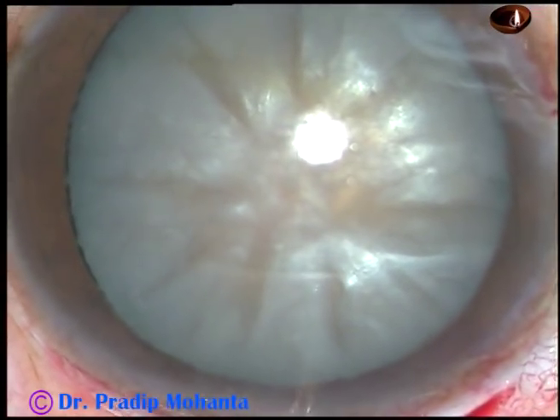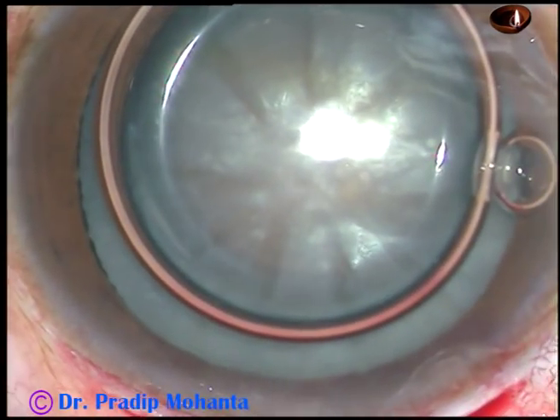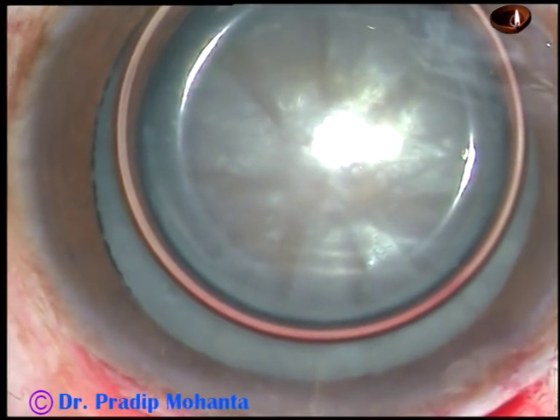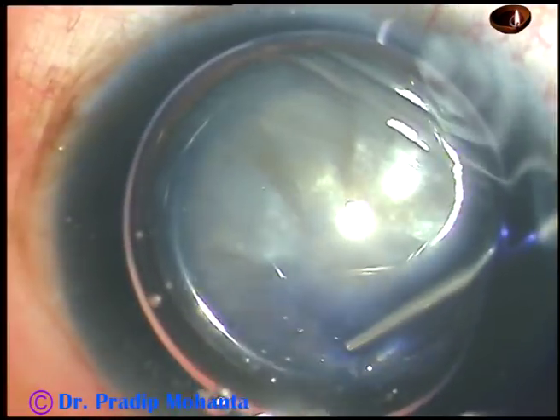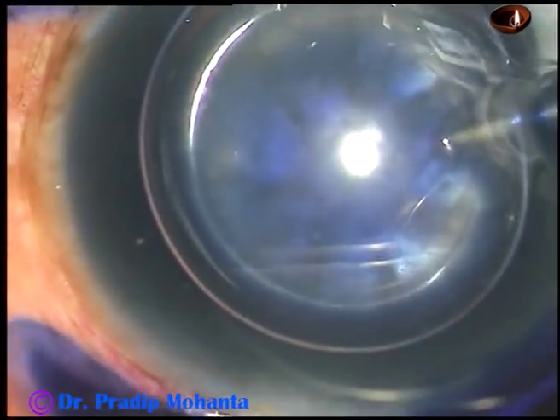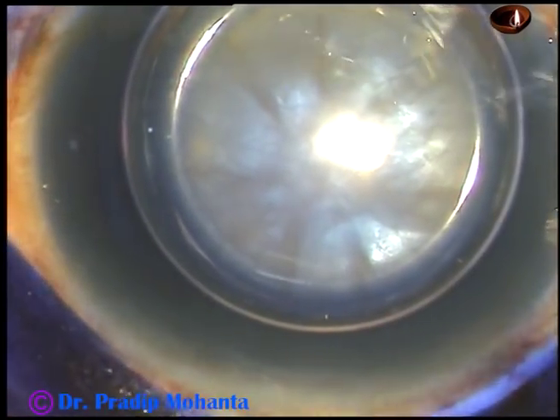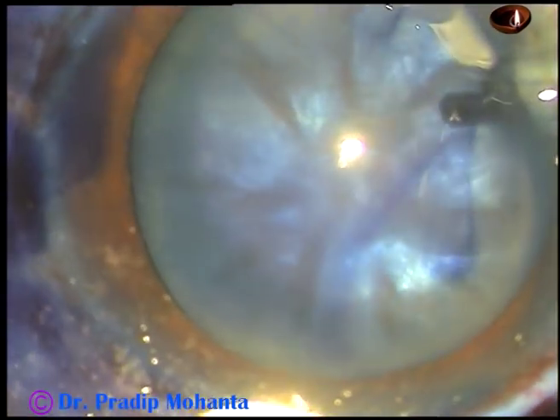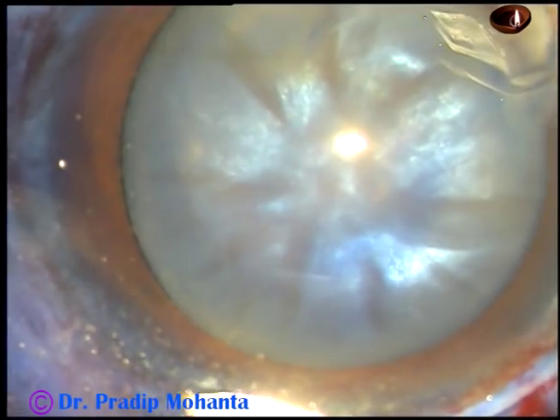Inject an air bubble. Use trypan blue dye underneath this air bubble to stain the anterior capsule. If you stain the anterior capsule, you will be able to see the capsule very nicely and you can do capsulotomy very confidently.